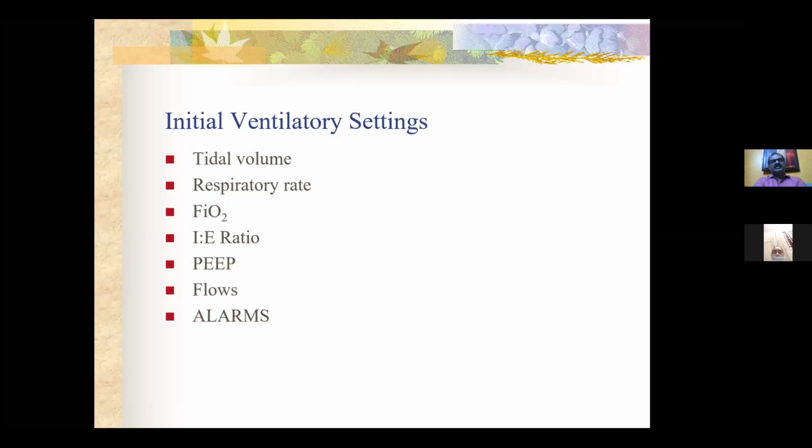How much tidal volume and respiratory rate you have to fix. One thing you have to keep in mind is that maybe the patient is very tachypneic. You're thinking around 40, 50, something like that when the patient came in. And you are never going to go step by step. We'll see what happens.